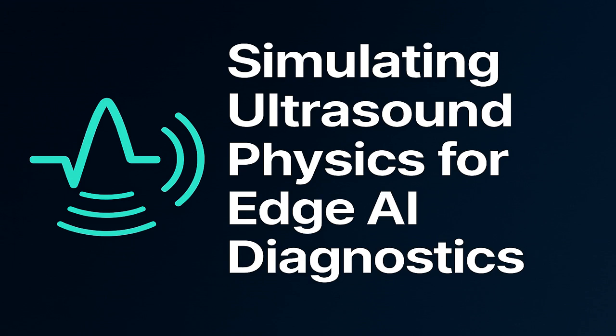And all this precision brings us directly to a computational problem. A huge one. If you're trying to simulate the interaction of a single wave front with, I don't know, thousands or even millions of tiny scatterers in a virtual phantom, keeping track of every interaction in the time domain is just computationally crushing. It's basically impossible to do in real time, which is why we pivot. We pivot to the power of the frequency domain using the Fourier transform.